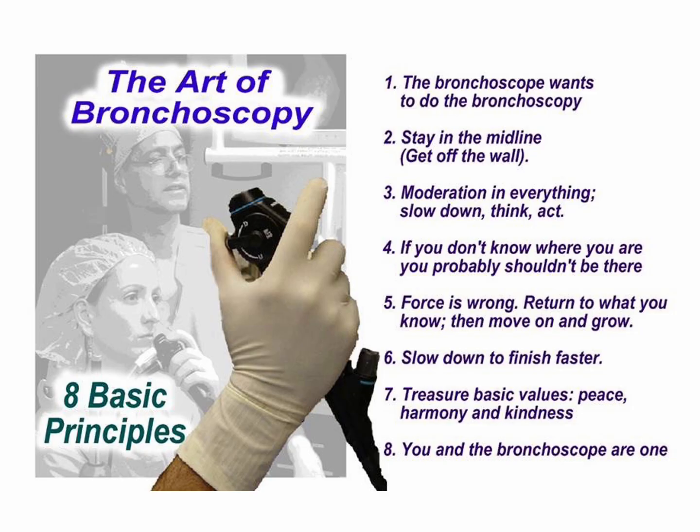In this lecture, we reviewed common tracheal abnormalities encountered during bronchoscopy, including morphologic variants, inflammatory disorders, infiltrative disease, dynamic airway collapse, malacia, stenosis, neoplasms, airway compression, and miscellaneous structural abnormalities.